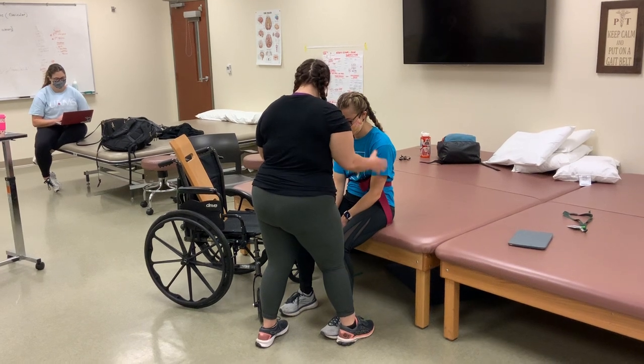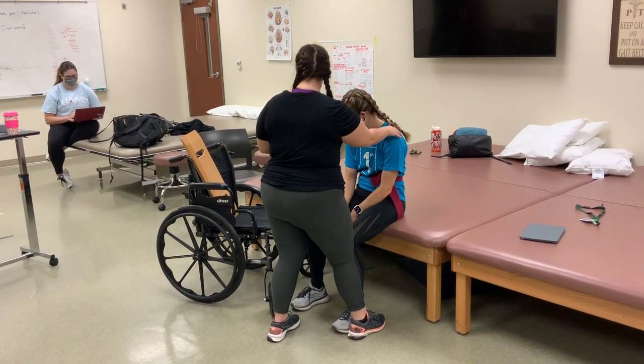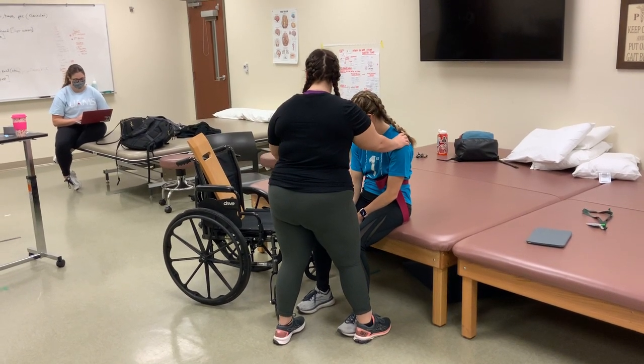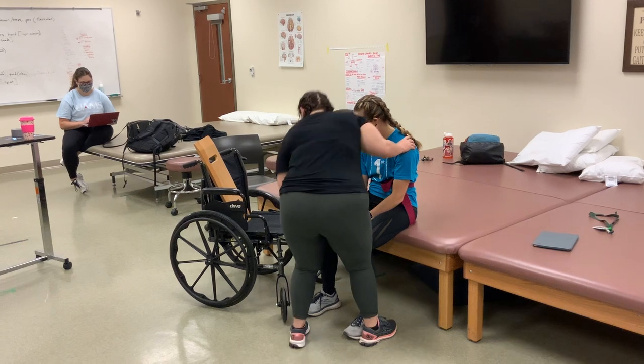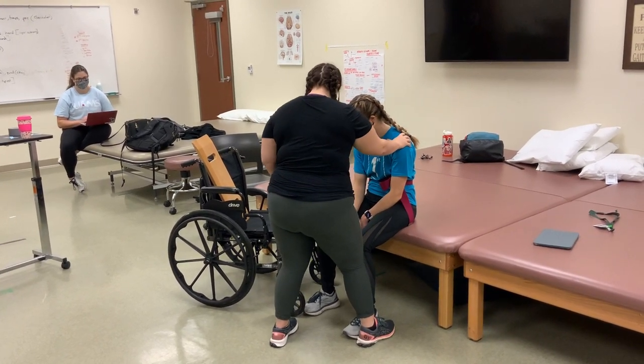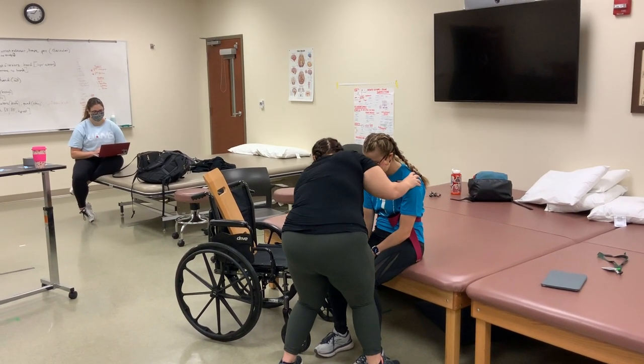Okay, Brooklyn. I'm going to be transferring you from your bed to your wheelchair today. First, I want to make sure the wheelchair is at a 30-degree angle from the bed — looks good. I'll remove the armrest as a barrier, fix the wheels so they're locked, and make sure your feet are flat on the floor. You've got two shoes on. I'm going to bring it a little bit closer here.